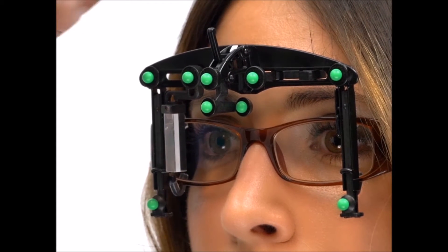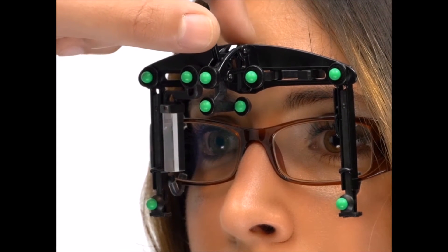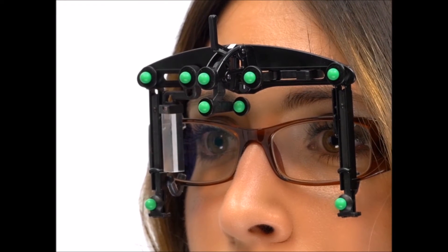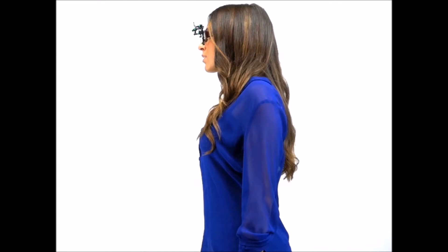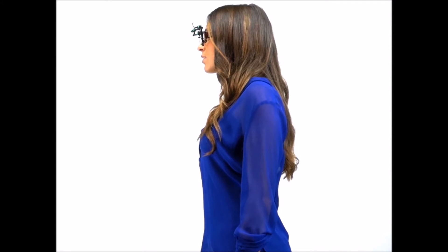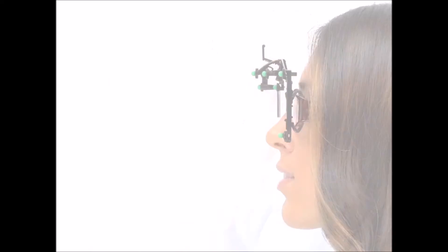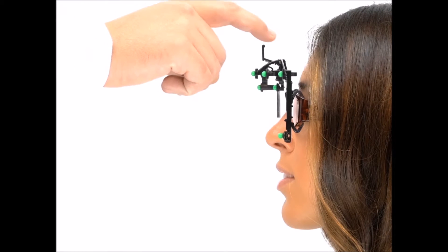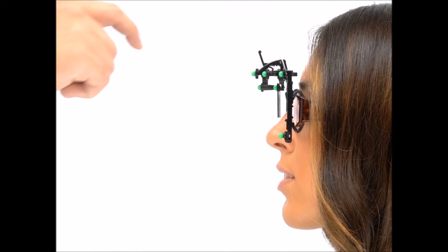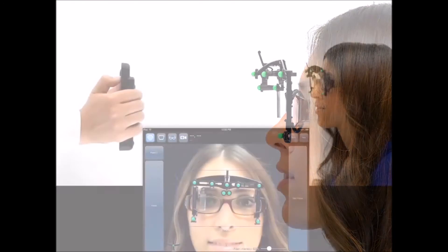First, unlock the swing assembly by lifting the brake arm. Next, make sure that the patient assumes their natural posture. You can either capture the patient's standing posture or their sitting posture based on the patient's lifestyle. When ready, apply a slight pressure on the brake arm to lock the swing assembly.